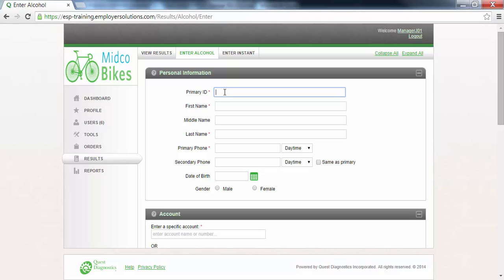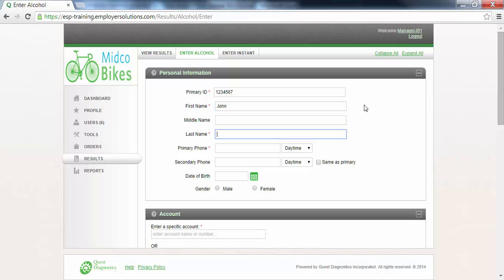Enter the primary ID. This should be a set of alphanumeric characters that are unique to the donor. In this example we will use the numbers 1 through 7. Enter the donor first name — in this example we will use John. Enter the donor last name — in this example we will use Miller.